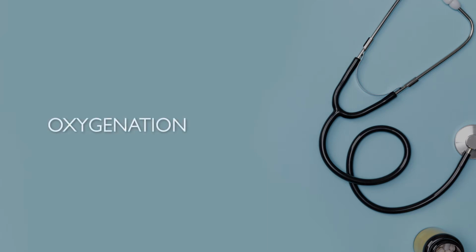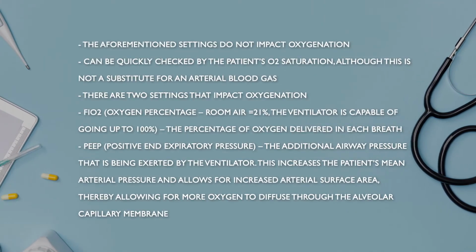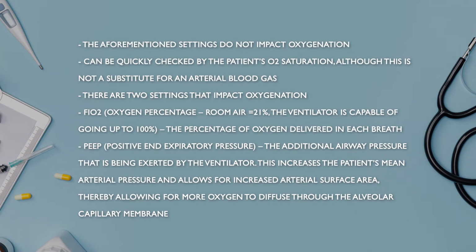Oxygenation. The settings we discussed do not impact oxygenation. Respiratory rate and tidal volume equal a patient's minute ventilation. That is strictly a ventilatory setting. Now we're going to discuss oxygenation because we need to provide both for the patient.